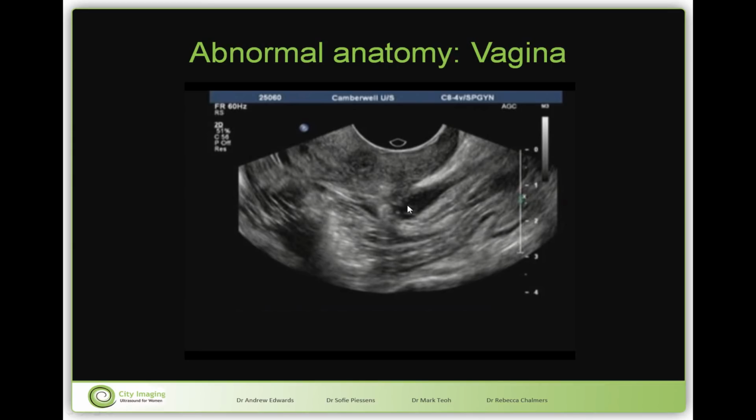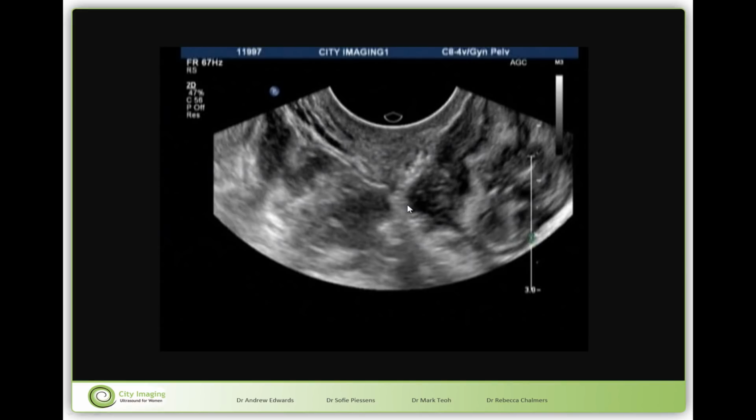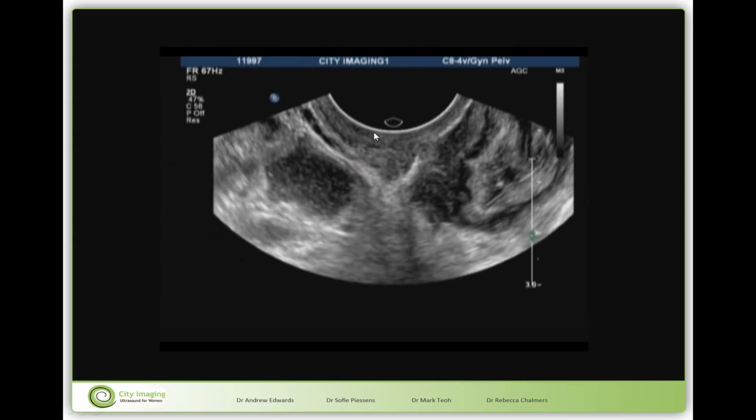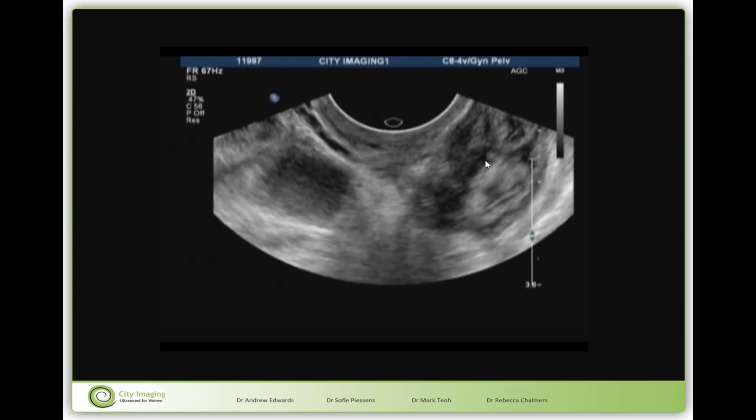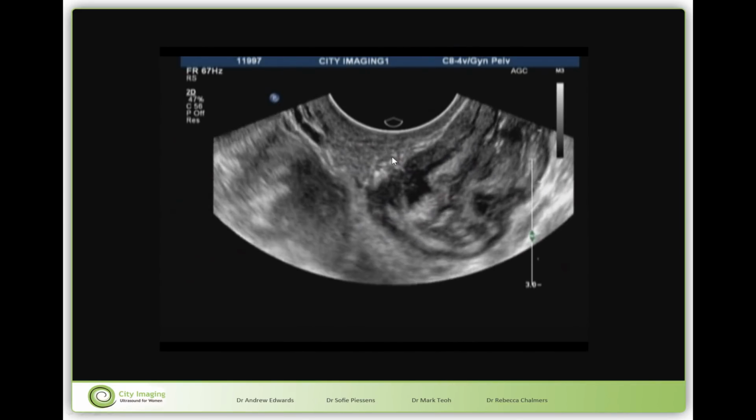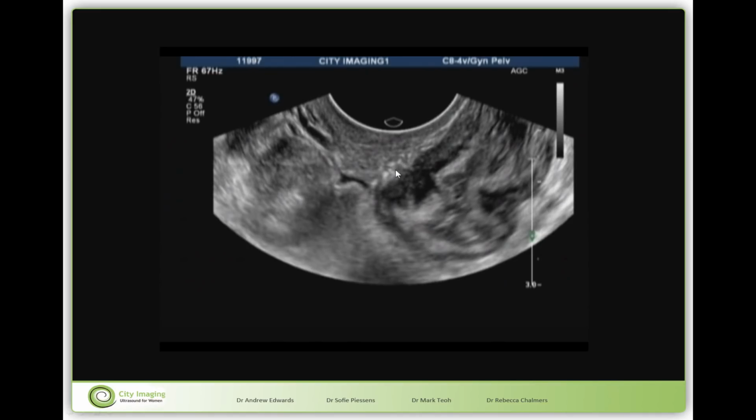And I show you a slightly more subtle clip. So this is the vaginal nodule, and this is the bowel nodule, and this is normal vaginal wall. So when I play the clip, normal vaginal wall, but here thickened vaginal nodule, bowel nodule, and the interface between the two tightly stuck.